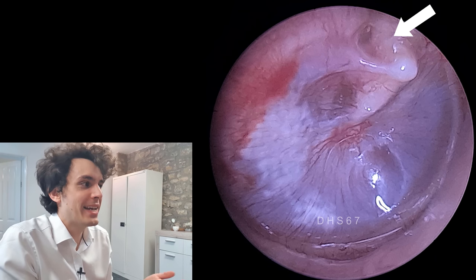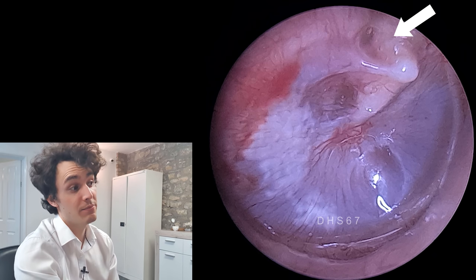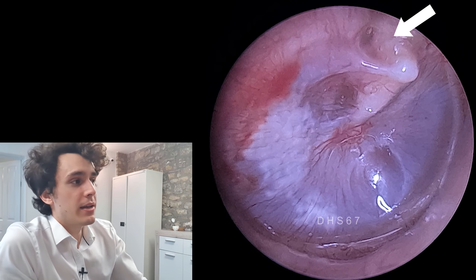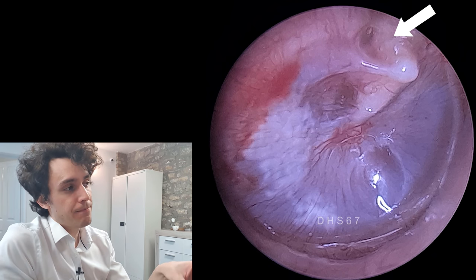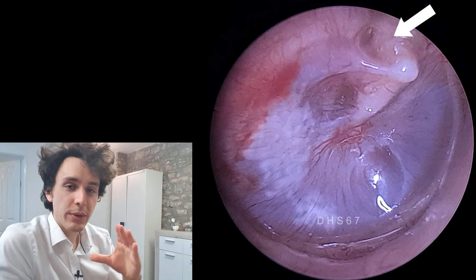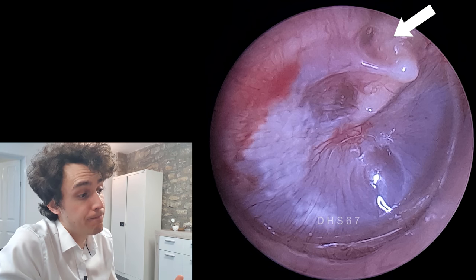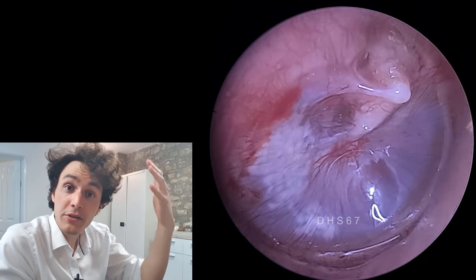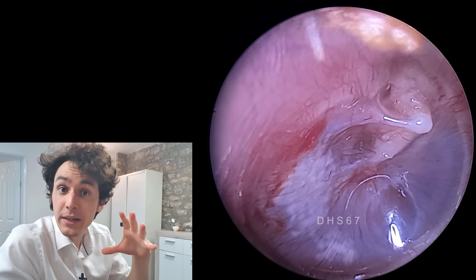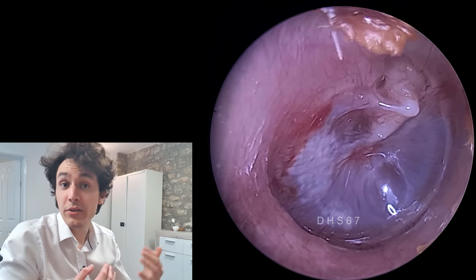Technically a grommet isn't a cure — it's merely alleviating the symptom of eustachian tube dysfunction for a while. The eardrum is tightly wrapped around the handle of the malleus and the lateral process of the malleus, so it is very gently being sucked backwards. It's a bit like when you're up in an airplane and start to descend — you get that weird feeling in your ear because the eardrum is being retracted, just due to a difference in air pressure.